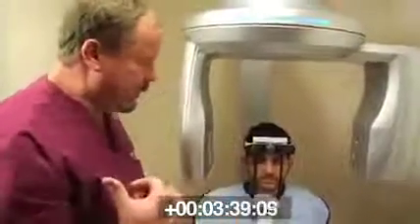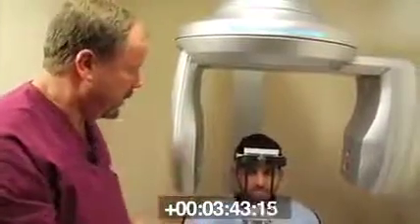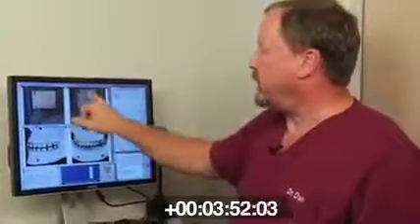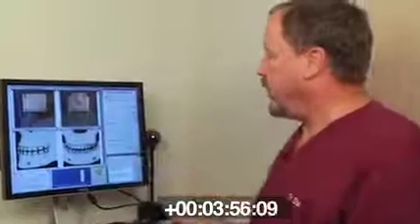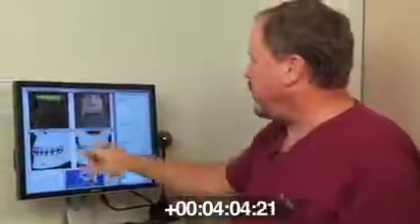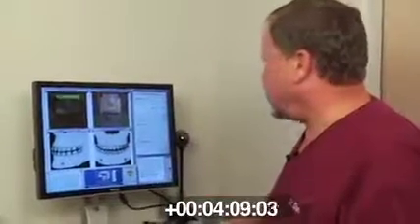So we'll step back out to the monitor and we'll show you how we position the patient remotely on the TV monitor itself. The patient is seated, and now we're going to position off of the screen here on the TV. And you'll see up here 2 highlighted areas that actually show the areas of interest where we're going to be doing our scan. So we'll do next here. It always brings up a screen for safety to make sure your patient's seated, everything's locked into place. And right away you'll see up here on the screen a video image event.